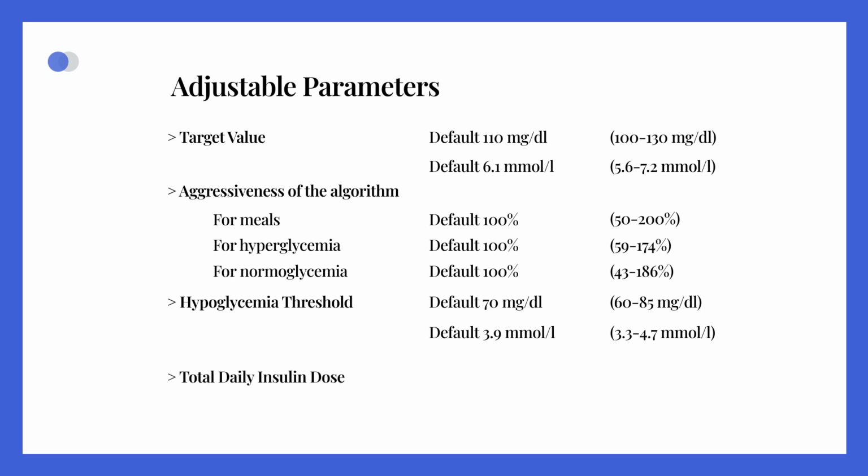Total daily dose. This is the main setting to fine-tune the global glucose management by the system. It should be reduced in case of too frequent hypoglycemia, or on the contrary, it may be increased in case of too frequent hyperglycemia, postprandial or fasting. Note that while you can modify the total daily dose of insulin between 8 and 90 units per day, frequent adjustments may affect the long-term auto-learning of the system. So it is recommended to avoid frequent changes, and by steps of no more than 10%.